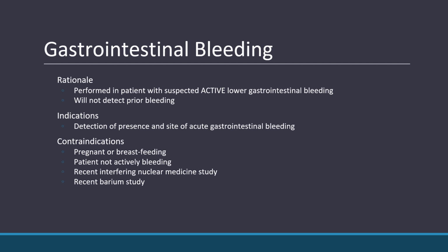Any interfering nuclear medicine study, this would be anything that is excreted through the bowel or shows any activity in the abdominal area or the bowel. And then a recent barium study, that barium will attenuate the activity, and that could cause a false negative.